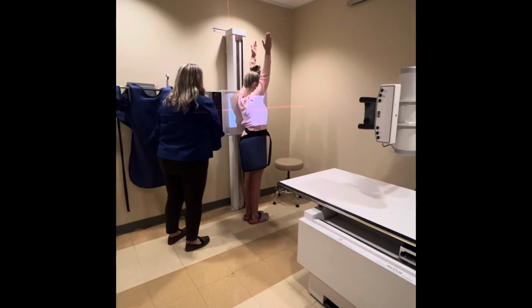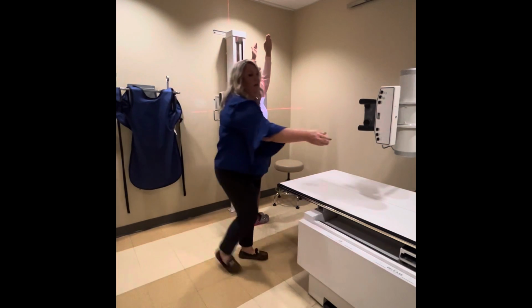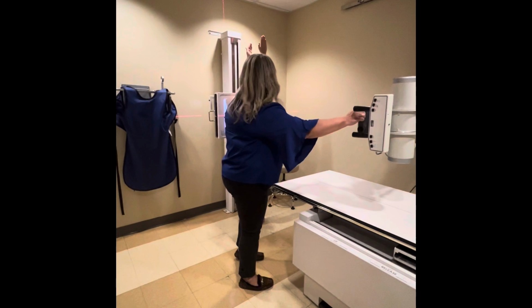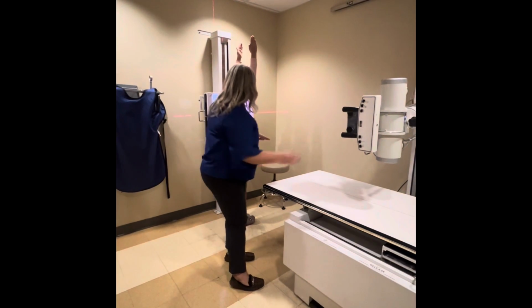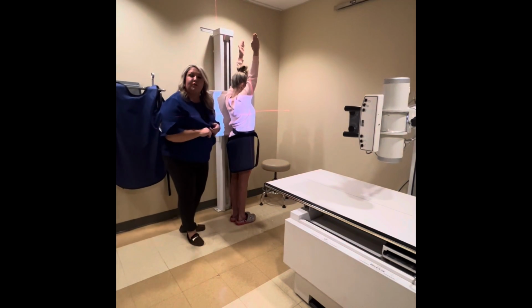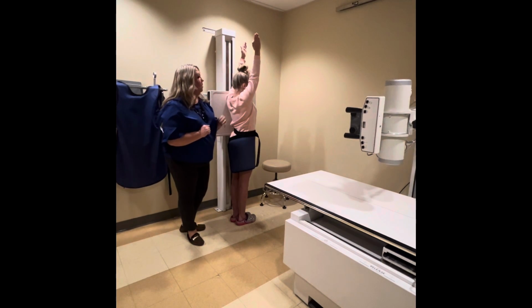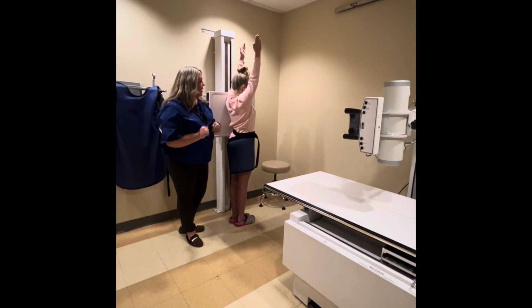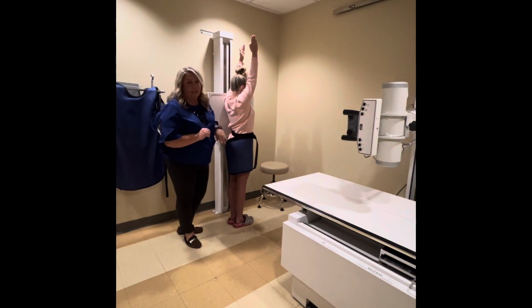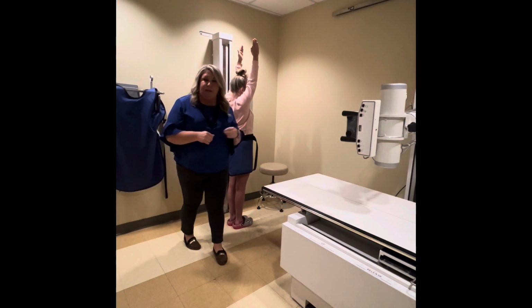And because I've dropped down our wall bucky, I also need to drop down our central ray so that we still have our two-part alignment. I'm going to change the collimation and we are good to go. So it'll be the same breathing instructions as before. I'm going to have you take a big breath in and blow it all the way out. And another big breath in and hold it. You can go ahead and breathe. And then we would shoot our exposure while she had that second big breath in.